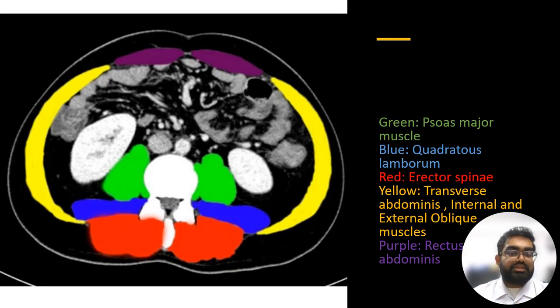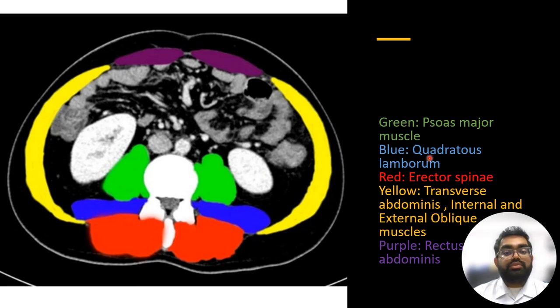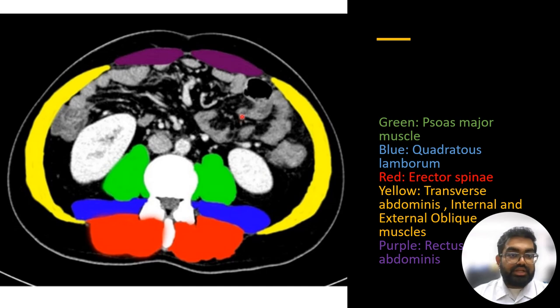Here is an image of CT at the L3 vertebral level. The green area represents the psoas major muscle. Blue represents the quadratus lumborum muscle. Red area represents the erector spinal muscle. The yellow area represents the transverse abdominis, internal and external oblique muscle. And lastly, the purple area represents the rectus abdominis muscle.